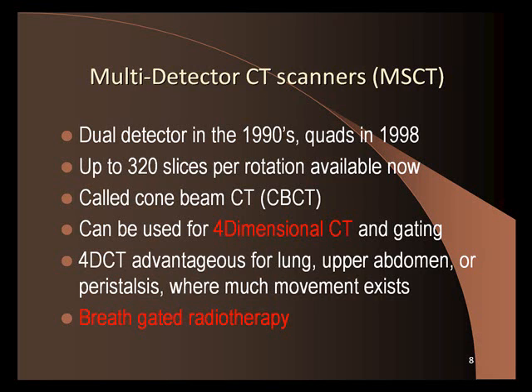For example, if you do a leg and then you scan it again, it's going to look the same as long as the patient didn't move. But if you do a lung and you scan it and then maybe 10 milliseconds later you scan it again, and again, and again, they're going to look different because the patient's breathing. Okay? And that's what we want to do.